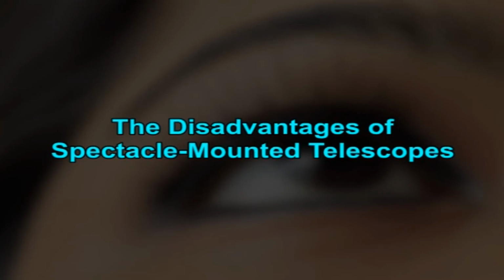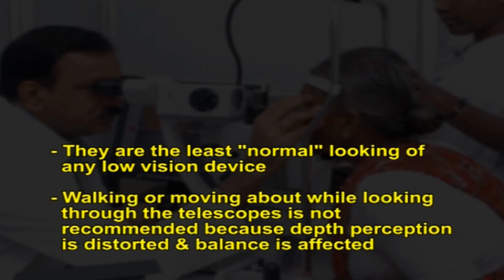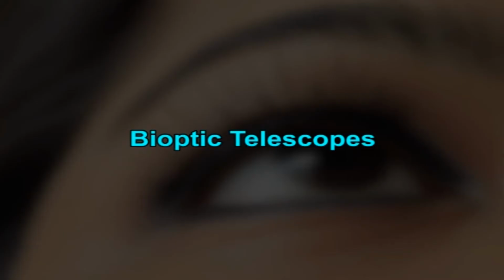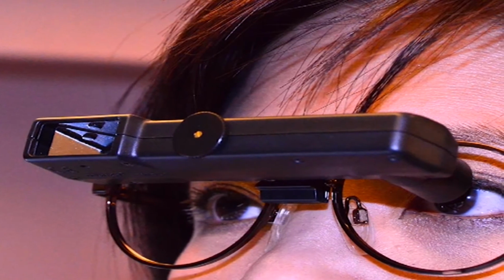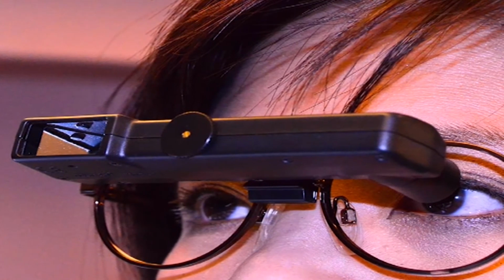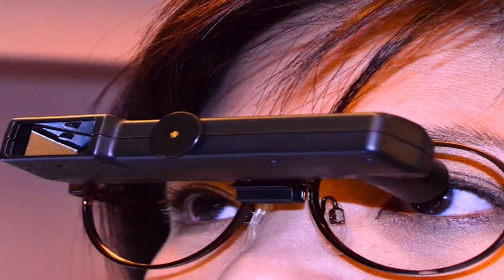Some of the disadvantages of spectacle mounted telescopes are they are the least normal looking of any low vision device. Walking or moving about while looking through the telescope is not recommended because depth perception is distorted and balance is affected. Bioptic telescopes. It is mounted on the upper part of each eyeglass lens. This placement allows the user to look through the bottom half of the lens while walking and then stop and look through the telescopes to read a sign or identify a person.